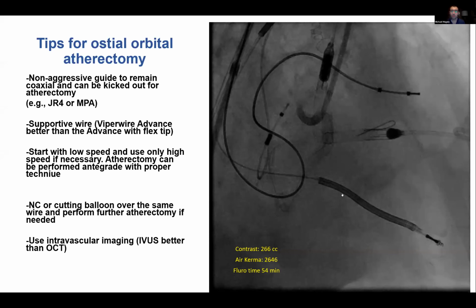I actually just have one question. Now we're talking about perforations. It might be the best way to ask and discuss it. So for perforations, we know we can use a ping pong technique if I have an 8 French system, or if we can use another guide. And this has been the classical way of doing it. So what do you think, and Lindsey, what do you think?